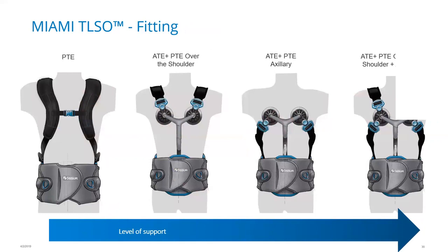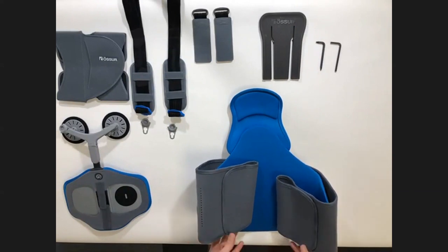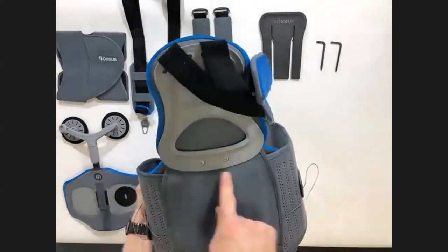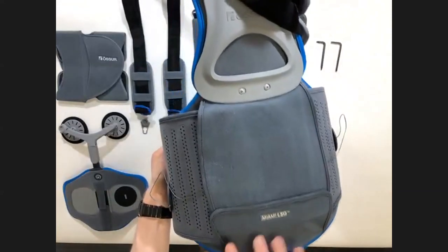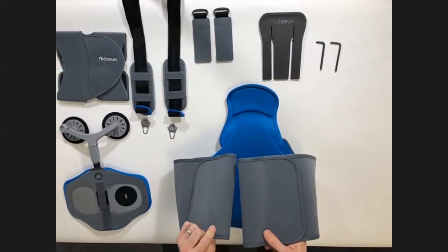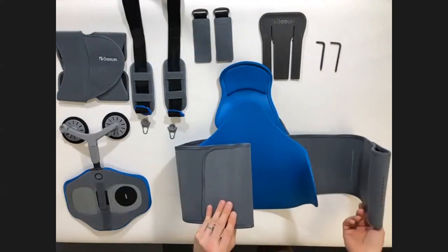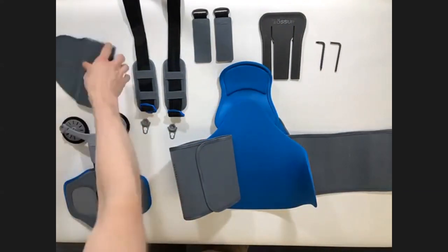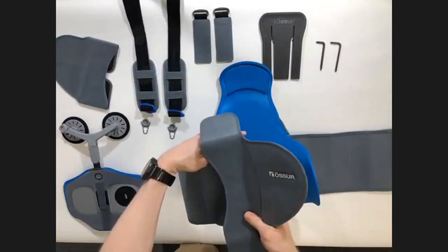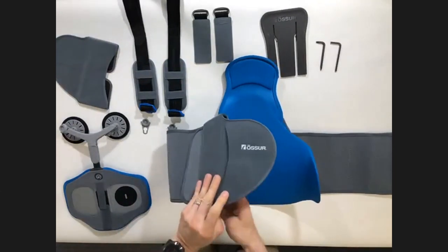So if we go over to the table camera, I can talk you through the setup of the system. This is exactly as it comes out of the packet, and you'll notice the posterior section is here with the belt already on it. If I turn this over, you can see that the belt is already added in here. It's a very simple pocket to set that up. And the belt is very easy to adjust. If you look at the front, there are these connections, and then this is a Velcro section, so you can adjust that and increase or decrease the length as needed. To attach these, the Velcro attachment at the front has a large section of Velcro, and that's very simple to add onto here, and it includes a hand pocket, which we'll show you later, in order to attach that back on.